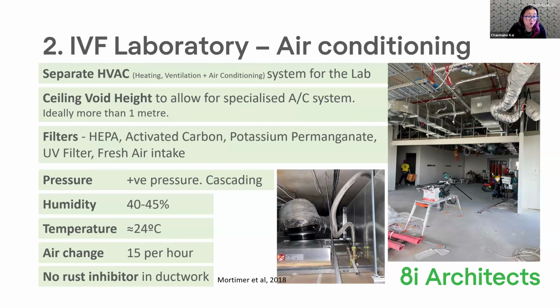Humidity, we'll generally try and look at 40 to 45%. That's actually quite high in terms of normal air conditioning. Normal air conditioning has generally a lot lower humidity, so it's something to be aware of.